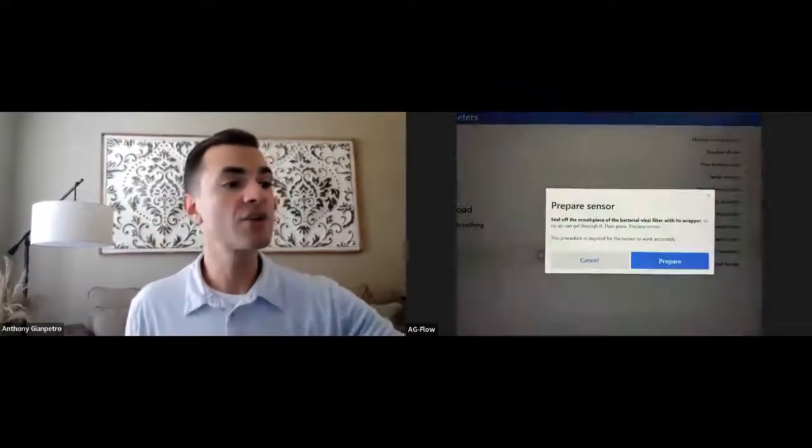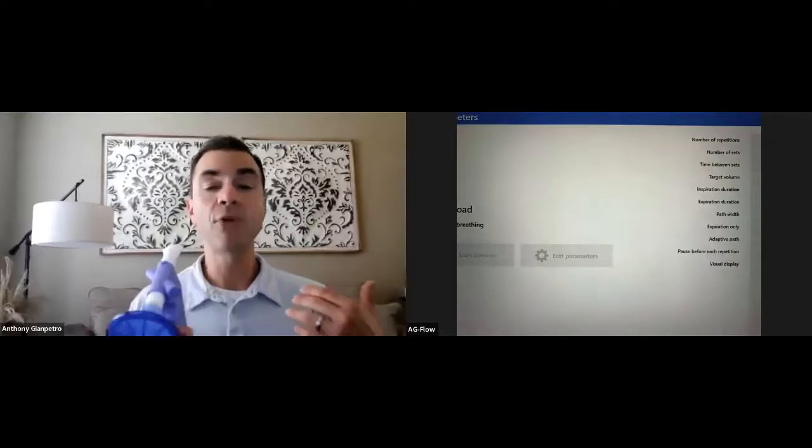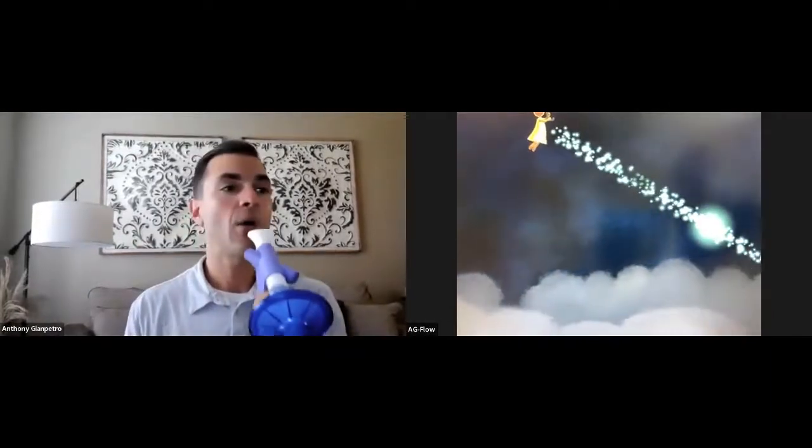I'm going to hit start exercise. And I'm just going to remind the patient that they're going to breathe in. And for the activity, they're going to just focus on the breath out. So they don't have to breathe in against the device is what I'm saying. And it's kind of a clever way that this is set up. I just wanted to get you guys to see that. Notice that it's just for the exhale, you're not going to see the upward star slope. Here's how it would go.